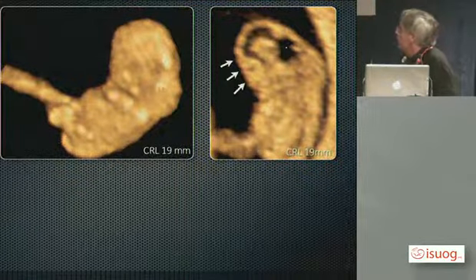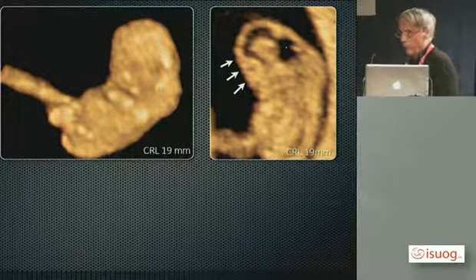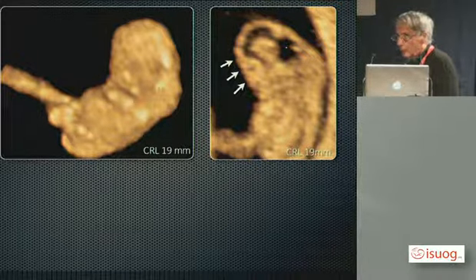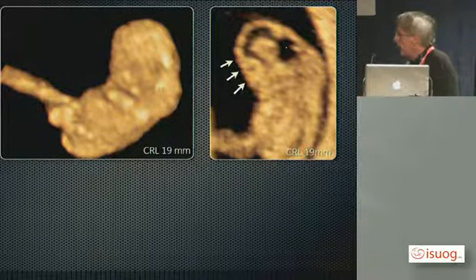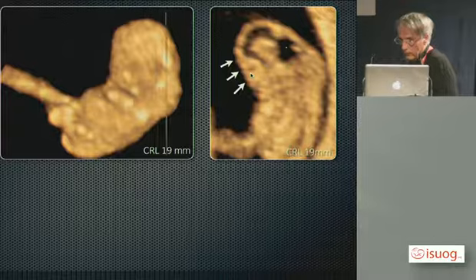Eight weeks of pregnancy, this lady with 2 previous pregnancies, the first one with holoprosencephaly, the second one with twin trap syndrome with one fetus acardiac. So I did a scan, and you can see here the anterior part of the head, the forehead is flat here. And it was not possible to identify the prosencephalon.